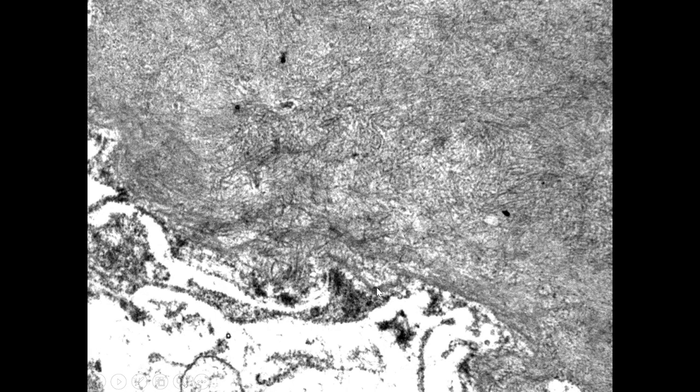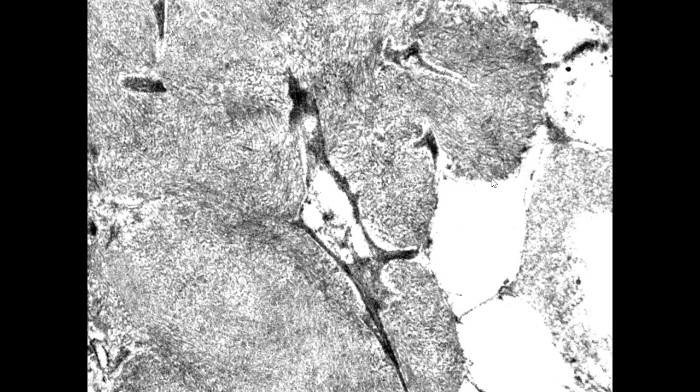And if we go to the higher magnifications, we can appreciate the fibrillary organization of these deposits. We have randomly arrayed fibrils, mainly in the mesangium, and you can see here these fibrils, and here at higher magnification, these randomly oriented fibrils.